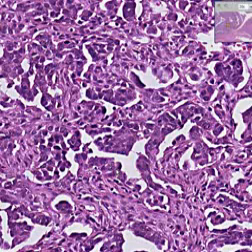Here are epithelial cells. Here is fibrous tissue. Here is fibrous tissue. Here are epithelial cells. Here's epithelial cells. Here's fibrous tissue. Here's probably a single epithelial cell. You could notice the striking difference right away.